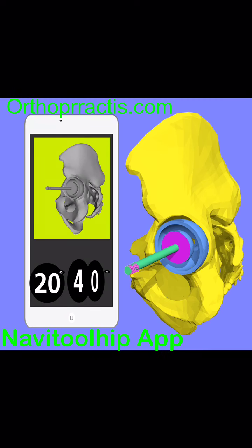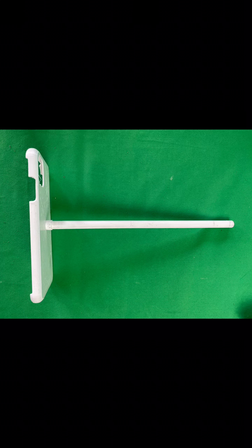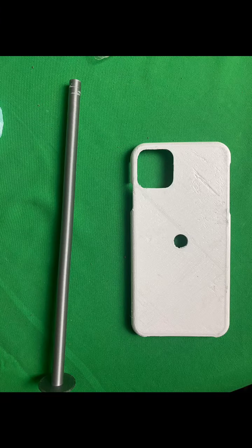For successful, accurate cup placement during THA with the aid of the NaviToolHip app, two physical devices, A, the case iPhone probe tool, CIPT, and B, the clamp tool, CT, have to be 3D printed according to surgeon preference. Material: stainless steel, Ultem or PEEK, which can be sterilized according to manufacturer-owned specifications and guidelines. STL or OBJ files can be downloaded for free from our website.